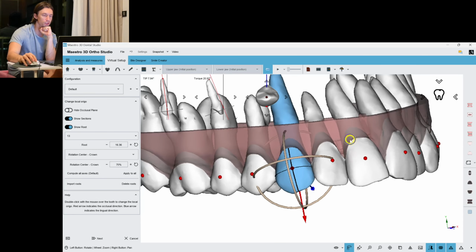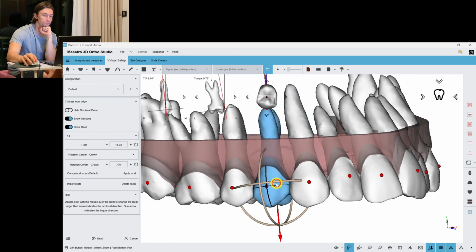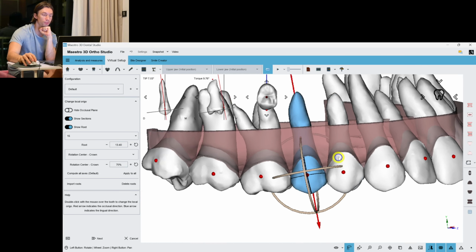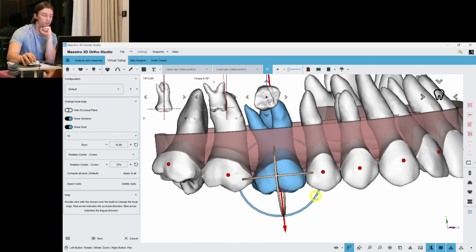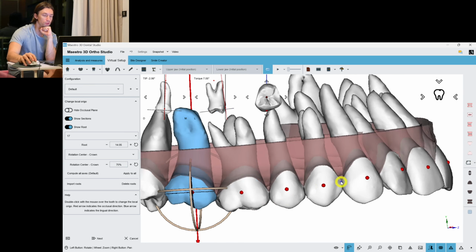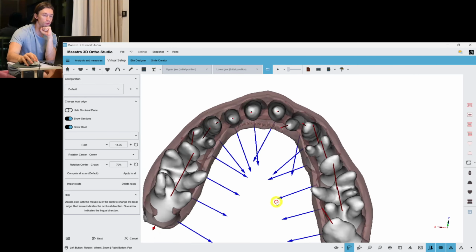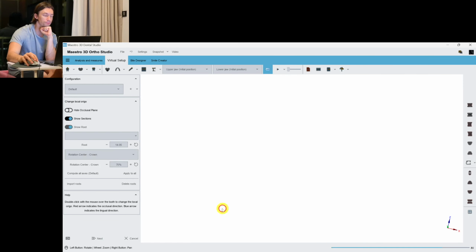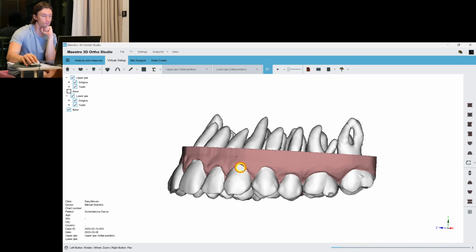So I can combine, for this case, I can start with Endura to perform the difficult movements and then finish with the Biolon or Veralite with some simple PETG material to save some money, because Endura is really expensive and it's not necessary for simple movements like tipping and rotation. Okay.